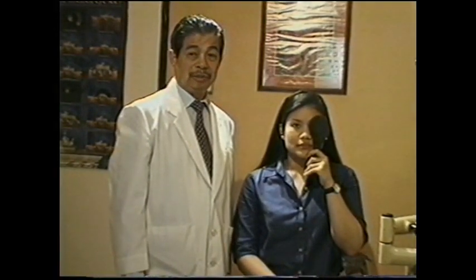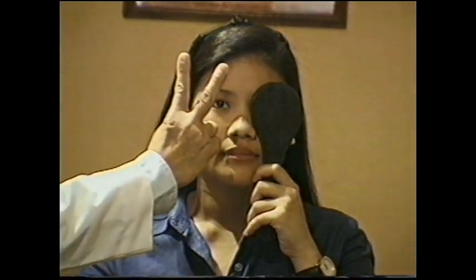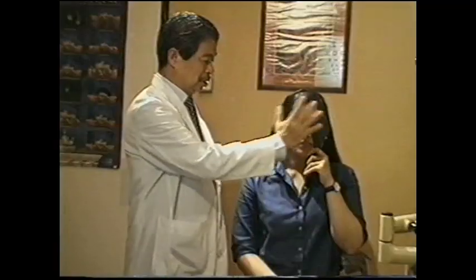Number 9. When a patient cannot see the top letter from any distance, record the maximum distance in feet or inches in which he can count the examiner's fingers, like so, counting fingers at 2 feet or counting fingers at 6 inches. Number 10. If he cannot count the fingers, the examiner moves his hand in front of the eye under observation and asks the patient if he can recognize any movement or shadow, and the vision is recorded as hand movements.